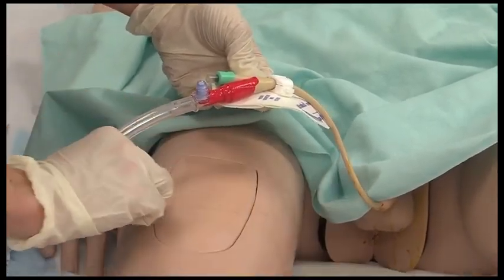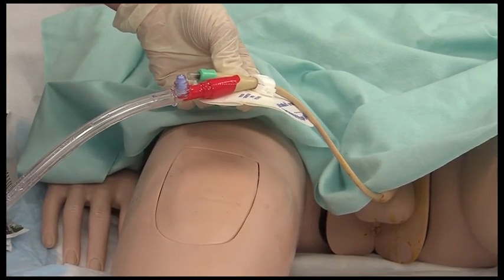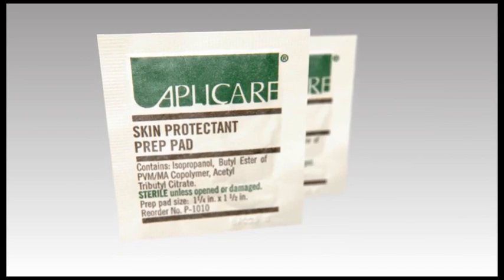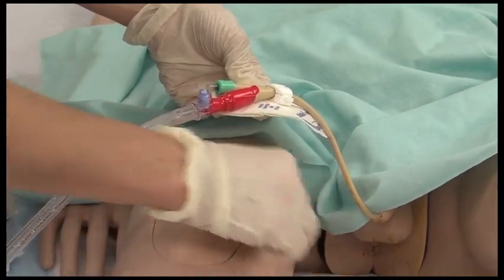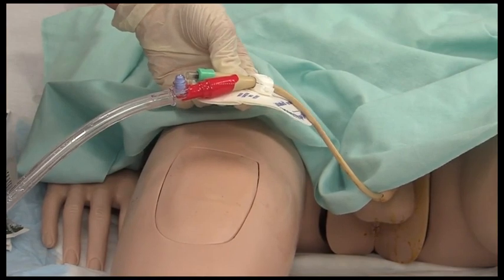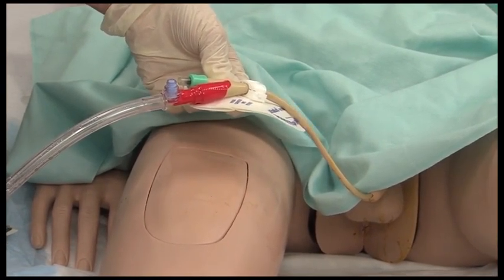Cleanse and degrease the securement site with alcohol or per hospital policy. Let skin dry. Apply the provided skin protectant using both pads in direction of hair growth to an area larger than the securement site. Allow to dry completely, approximately 10 to 15 seconds. Using a permanent marker, write your initials and date of application on the StatLock device anchor pad.